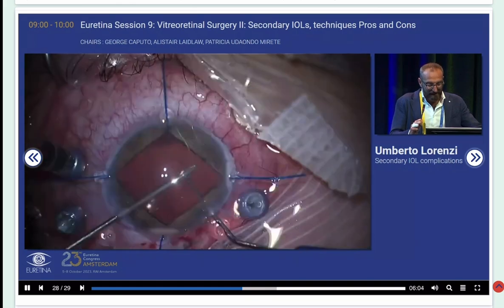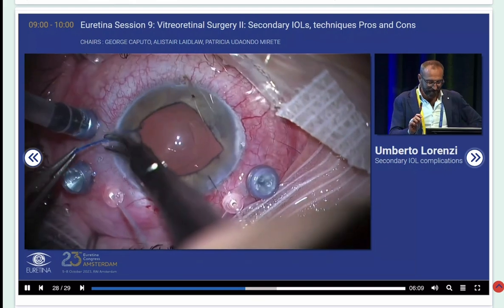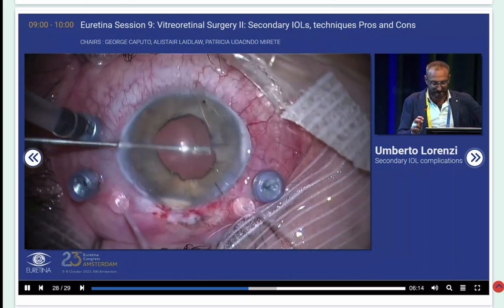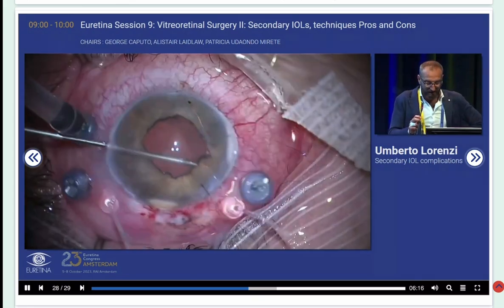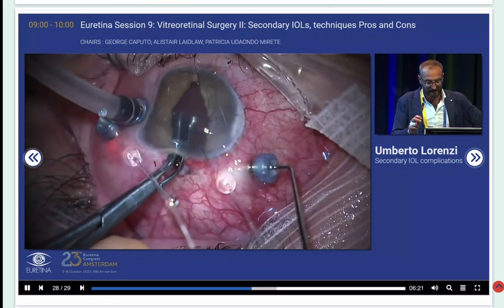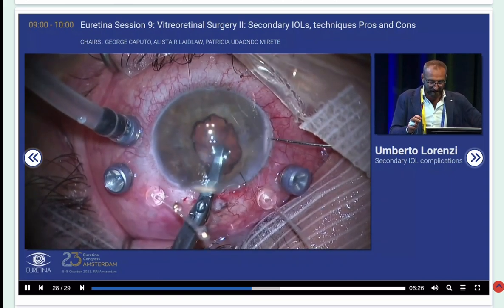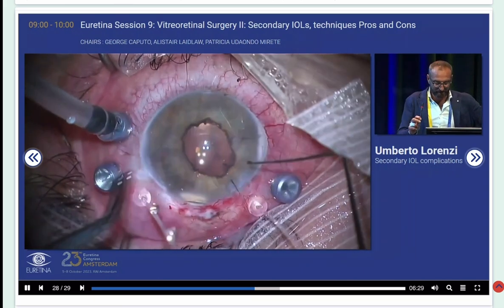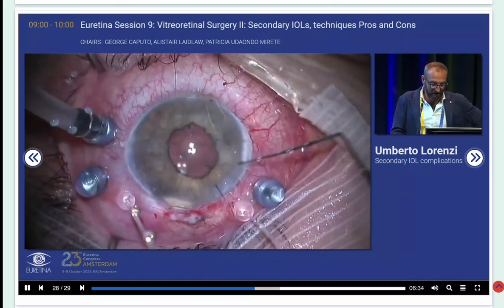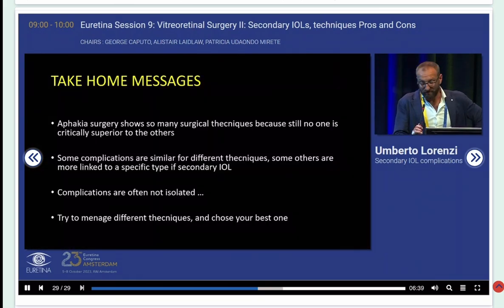And at the end, when we have PFCL in the eye, we remove the attachment of the iris claw from the iris. We tried with acetylcholine to have a miosis, but it was impossible, so mechanical miosis. And we refixed the Artisan posteriorly. And that's it. After that, I completed the fluid exchange, and we used Densiron oil as a tamponade because he is a one-eyed patient.